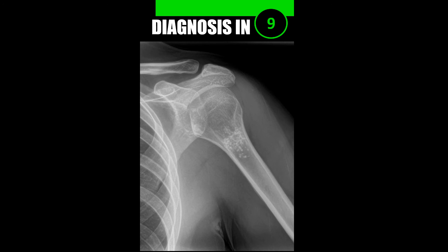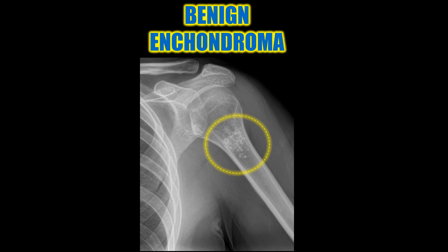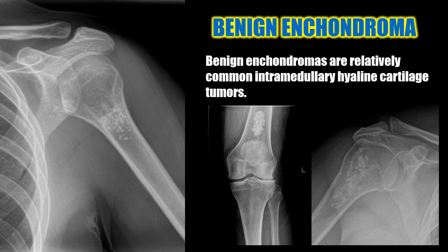Case number seven: here is a benign enchondroma of the proximal humerus. Benign enchondromas are relatively common intramedullary hyaline cartilage tumors. Radiographically they can show as stippled calcification and can look radiographically identical to bone infarcts.